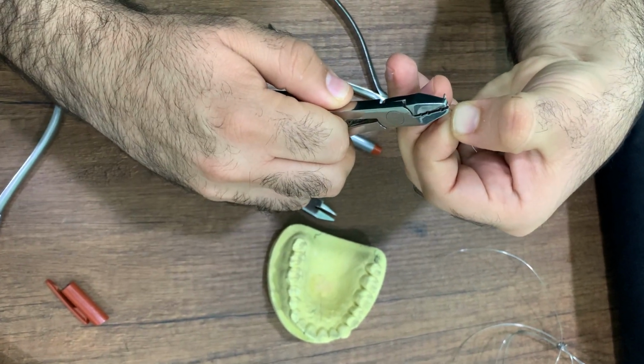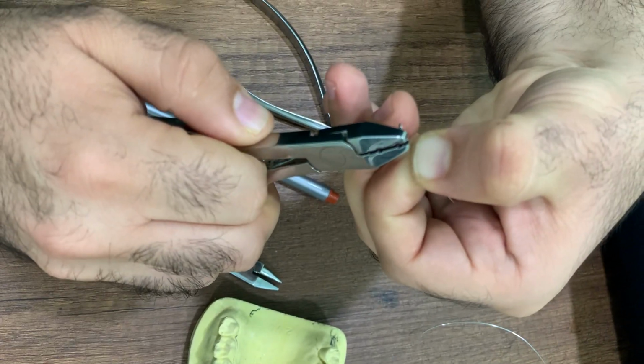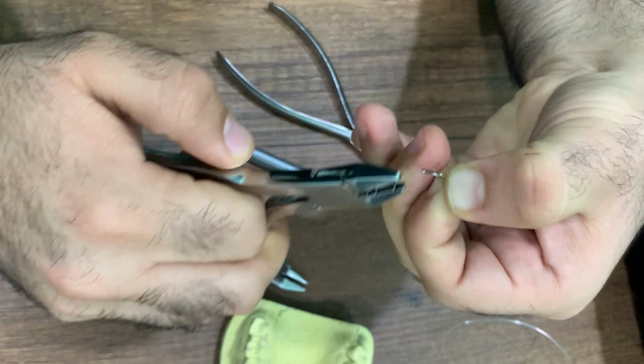We squeeze the U-loops a little bit to be passive.